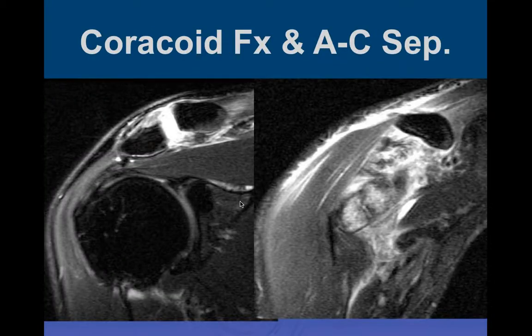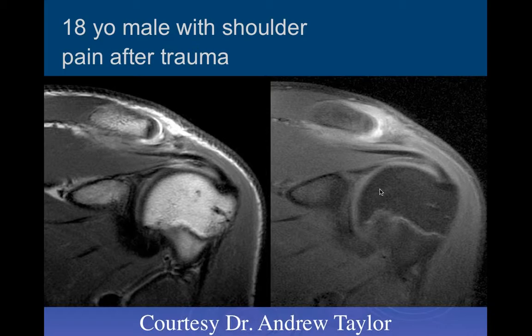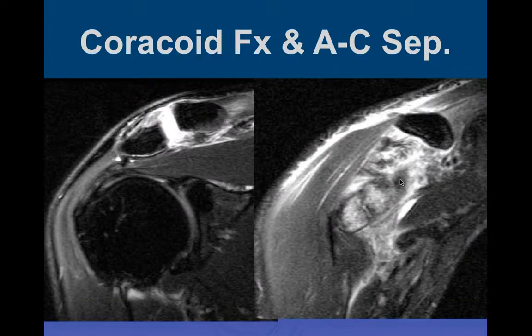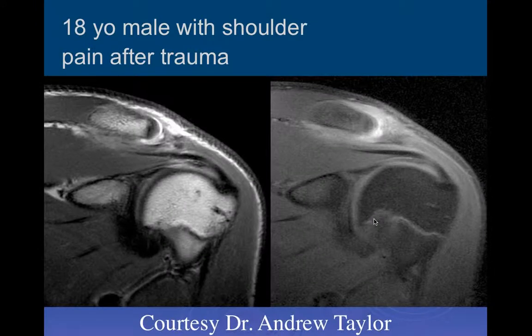Here's another case with AC joint separation and inferior displacement of the coracoid process, but in addition to the torn CC ligaments, there was an actual fracture of the coracoid process, which complicated treatment.